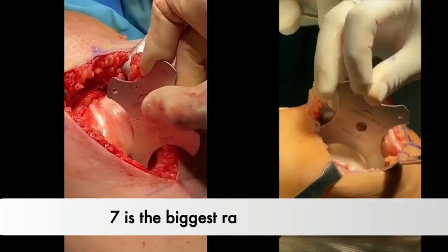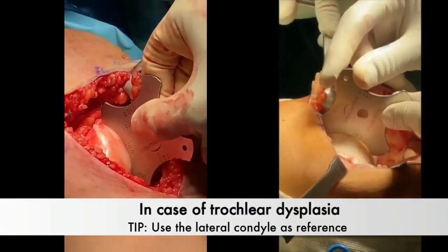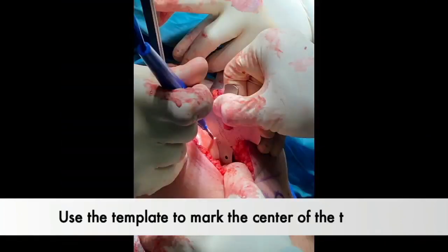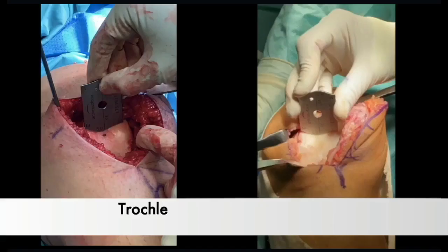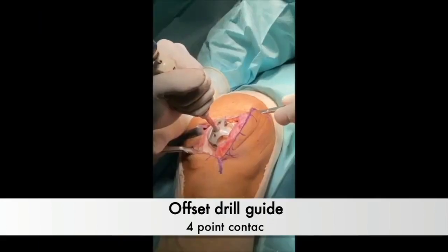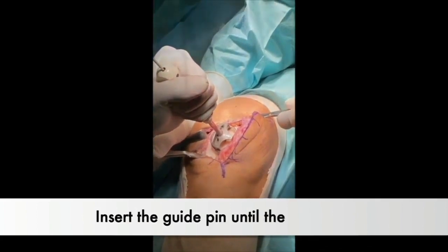The initial step involves sizing the trochlear groove curvature. In cases of dysplasia, we recommend taking the measurement on the lateral condyle. Next, the template is used to mark the centre of the trochlea, followed by measuring the trochlear groove depth. Position the offset drill guide ensuring 4-point contact, and insert the pin aligned with the mark previously made.